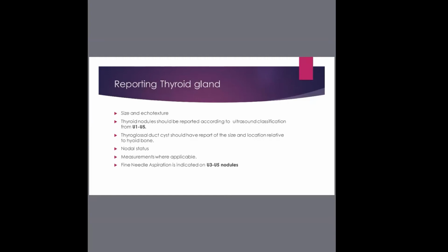Anything focal hypoechoic is suspicious until proven otherwise. On the thyroid, as a matter of fact, we fear anything hypoechoic. I'm going to give you the classification later, but I'm just giving you a rundown. So anything that is between hypoechoic and hyperechoic that is not clear, you either recall and do a rescan, or if you're not too happy, you do a biopsy.